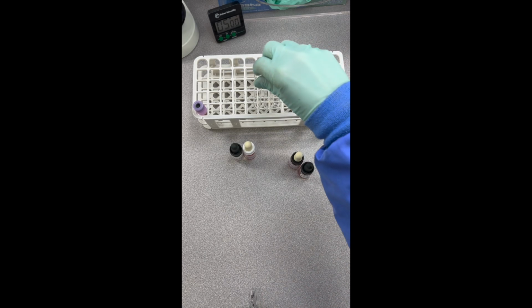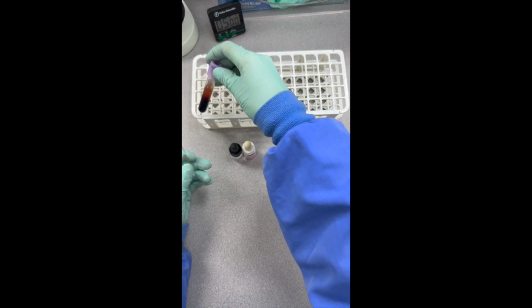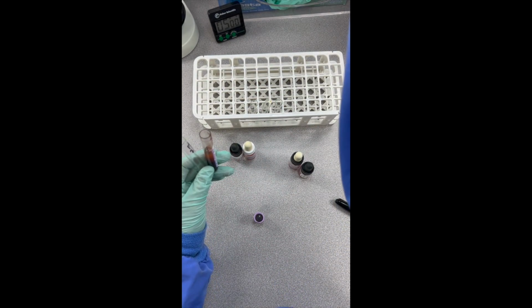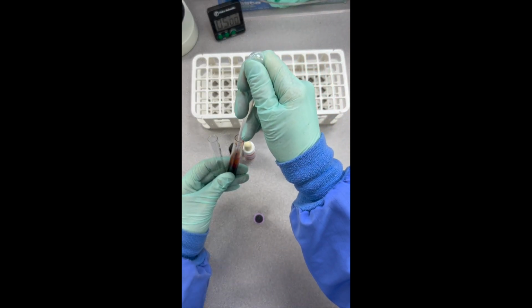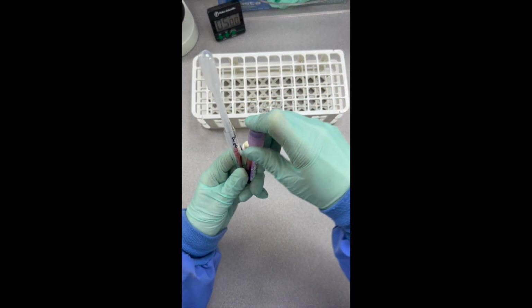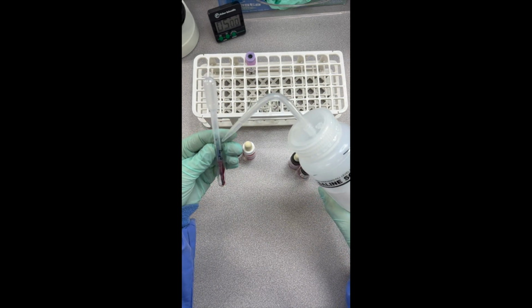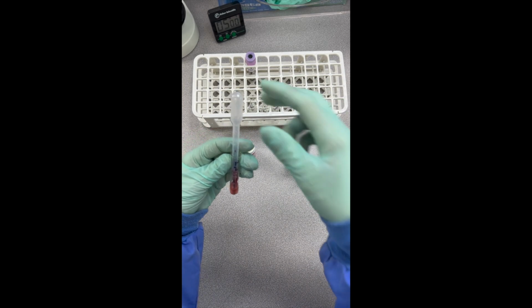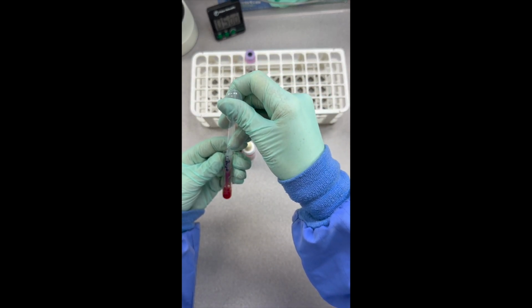I'm going to take them and put them right here in the rack. And then here's my sample. So I'll get a pipette from up here. I'll get a little drop of blood from down in here. Mix this in there. I'm going to add my saline, and remember, don't put the tip in the tube. We don't want it contaminated. So enough saline in there to make our suspension, and that looks pretty good.